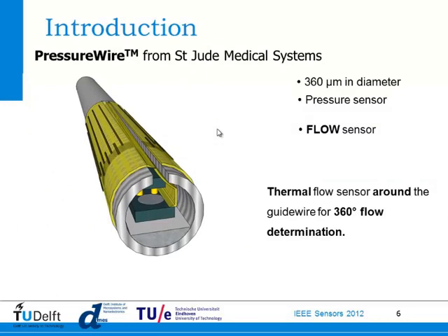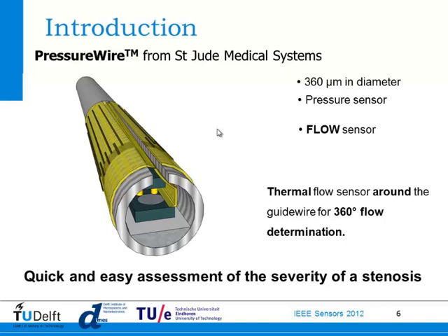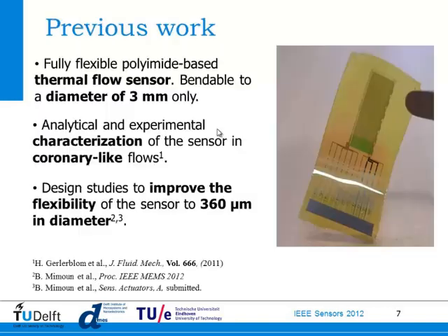Our idea is to basically band a thermal flow sensor around the guidewire, connected inside the silicon chip containing the pressure sensor, the electronics if needed, and the bondpads to go to the outside world. That would allow for quick and easy assessments of the severity of the stenosis.